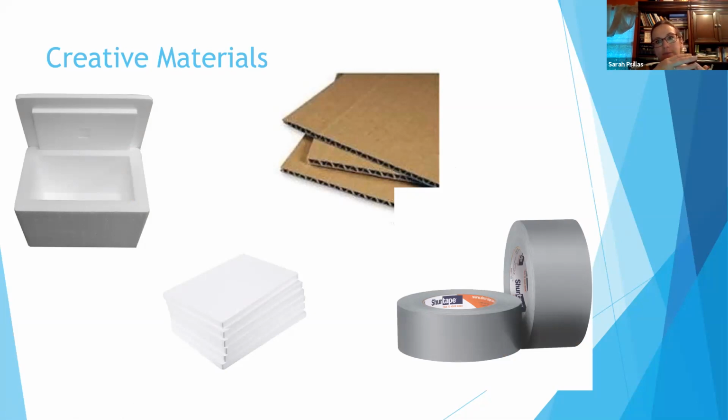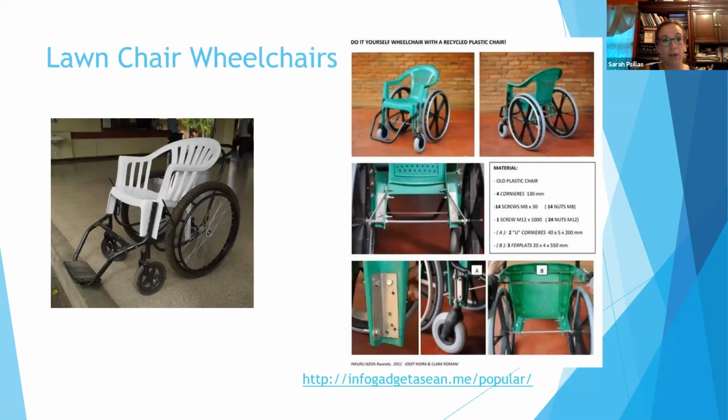And then that creates a really awesome solid seat surface if you need something to have a level seat in your seating system. And then duct tape is just great. I love duct tape. It's great to wrap around cardboard so that it's waterproof. It's great to hold things in position. So duct tape is my friend.